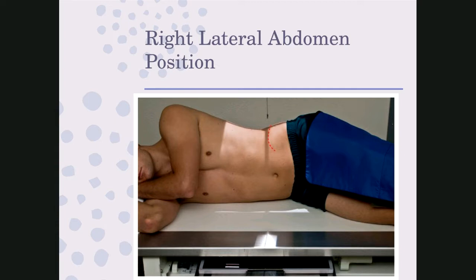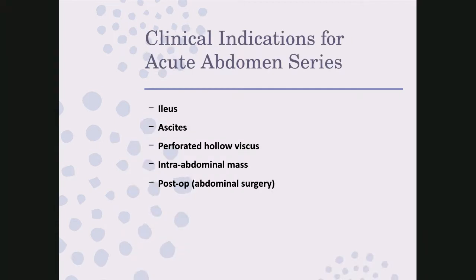All right. In this last section, they talk about clinical indications for what's called an acute abdominal series, or an AAS. Some of the reasons a patient might have an AAS, which is usually 3 views, and I try and tell you guys, an AAS has 3 letters, so there's 3 views. There is always 1 view of the chest and 2 views of the abdomen. But it depends if your patient is able to walk and talk or if they are non-ambulatory.